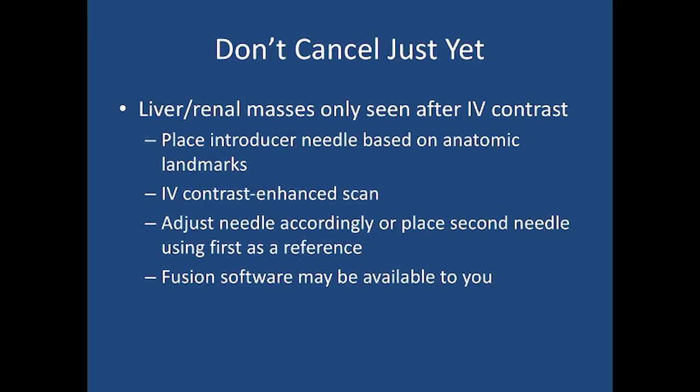Once the needle is in a proximate position based on anatomic landmarks, IV contrast is administered during the biopsy procedure. And at that time, either the needle that has been placed can be adjusted to get to the lesion itself if it were very close, or if it were quite far, that first needle can be left in place, and a second needle advanced into the lesion using the first needle as a reference or a marker needle.